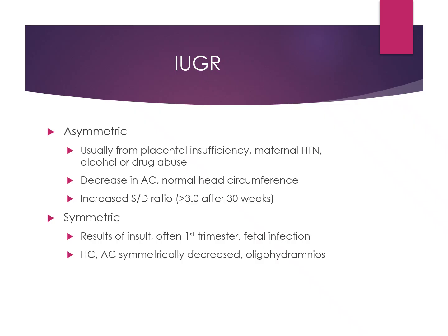And we know that because of our amniotic fluid index, or that AFI. If it's less than 5, or we don't have a deepest vertical pocket of at least 2 centimeters, that would qualify as oligohydramnios, or too little fluid in the gestational sac.